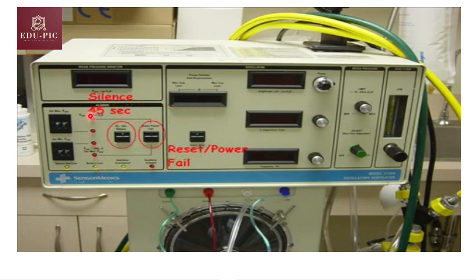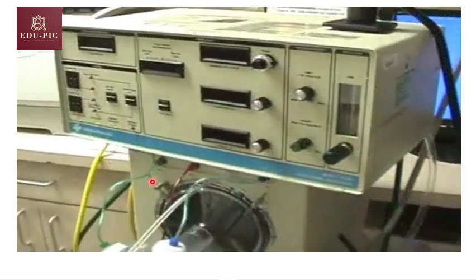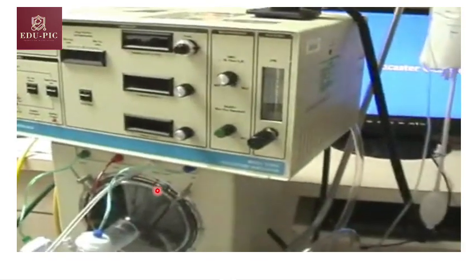Here you can set the maximum limit greater than 50 and the lower limit less than 20. Here is a silence button for 45 seconds, reset power fail. Here are some lights or lamps for low gas source, overheat or low battery, stop oscillation.